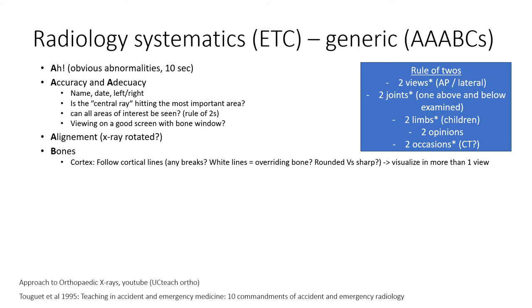It's usually where you will find pathology, but we usually use very little time there, according to Aaron Sayal. So we should use the lateral view first, and that's the main view for orthopedic surgery, as he usually says. So that was the cortex of the bone, like the peripheral.